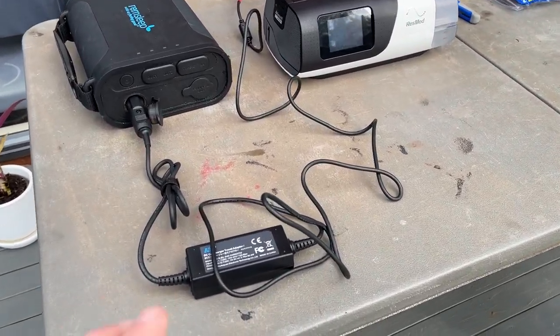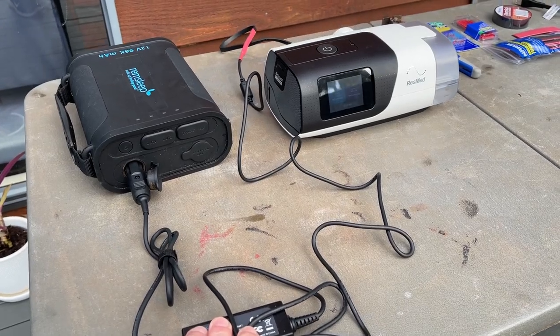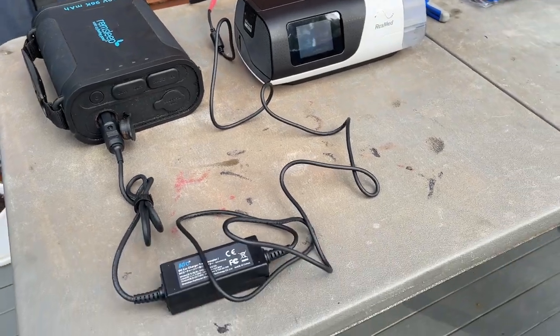G'day mates. Today I'm going to show you how to make one of these. It's a 12 volt to 24 volt DC converter cable so you can run your AirSense 11 on a 12 volt battery. All right, let's do it.